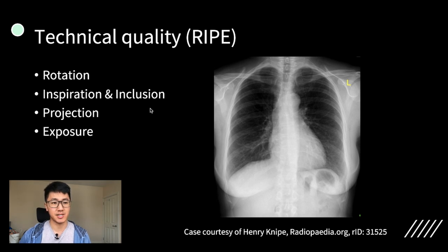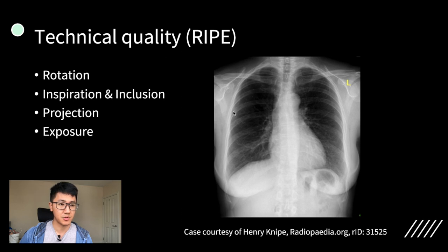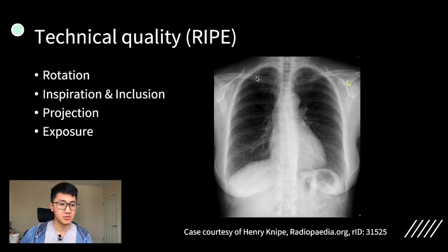Next is to look at inspiration and inclusion. For a chest x-ray, a patient has to have taken a big enough breath in, otherwise it can look like there's pathology in the lungs. To assess this, you want to count at least six anterior ribs. If you imagine the ribs attached to the vertebral column posteriorly, you can see those are the posterior ribs, and if you follow them around they become the anterior ribs. The anterior ribs seem to disappear in the middle of nowhere because they join the costal cartilages. Cartilage is less dense than bone so they don't show up as well. So you just count at least six of these anterior ribs.